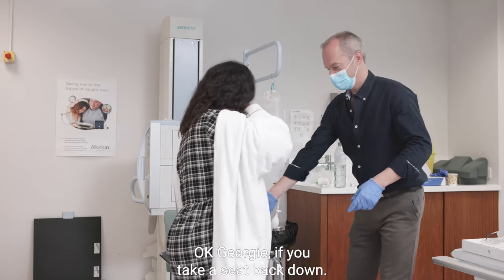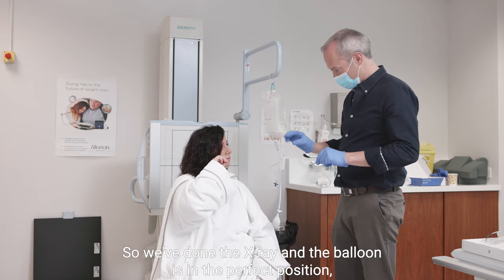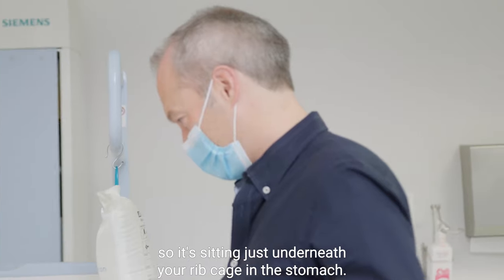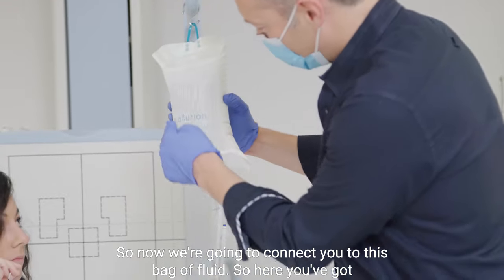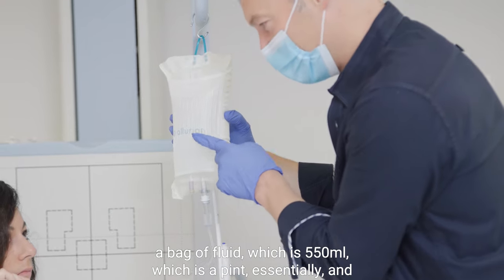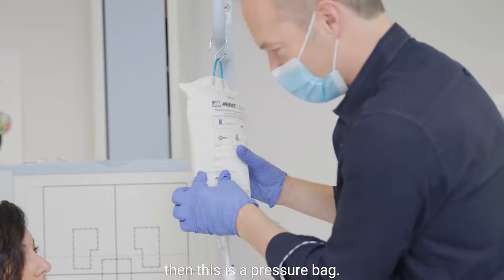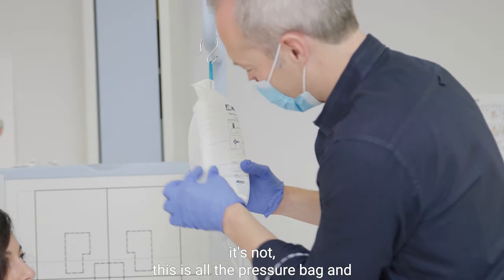Georgie, if you take a seat back down. We've done the x-ray and the balloon is in the perfect position — it's sitting just underneath your rib cage in the stomach. So now we're going to connect you to this bag of fluid. Here you've got a bag of fluid which is 550 mils, which is essentially a pint. And then this is a pressure bag. People worry that this whole thing is all water — it's not. This is the pressure bag and this is the water.